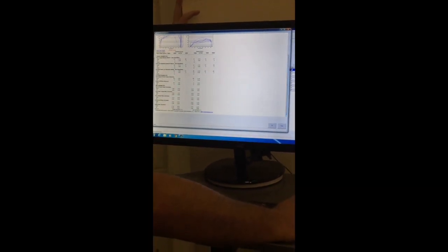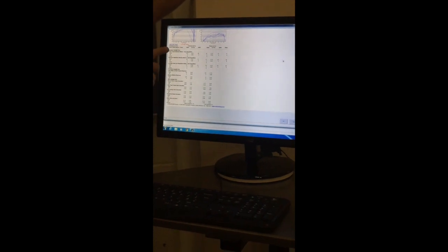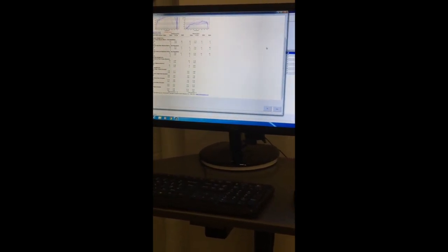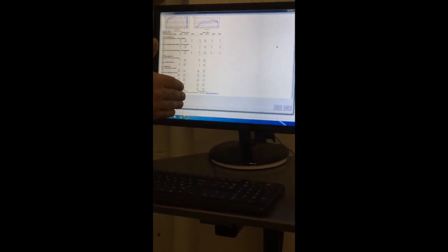Okay, so you'll have the graph again, and then you'll have all this peak torque, joint angle at peak torque, range of motion, so on and so forth, and it'll do it for extensors and flexors. And if you've done 60 degrees, you'll have one for 60 degrees per second. If you've done 180 degrees, you'll have one for that. So you'll have a graph on a printout like that for each speed that you've tested.